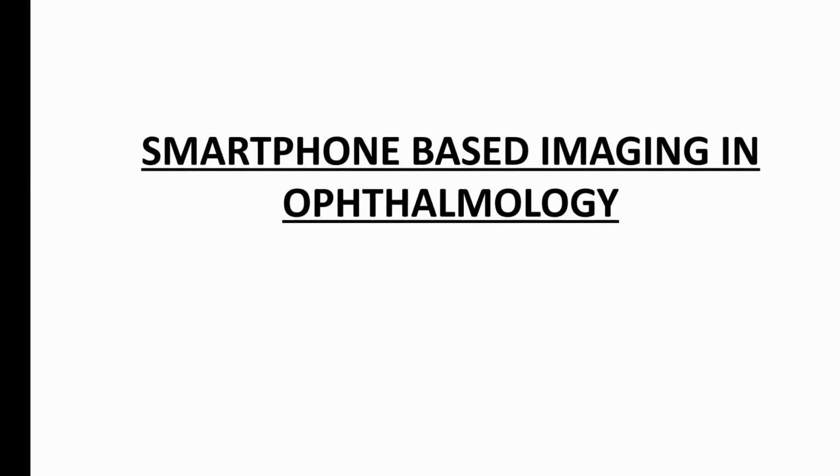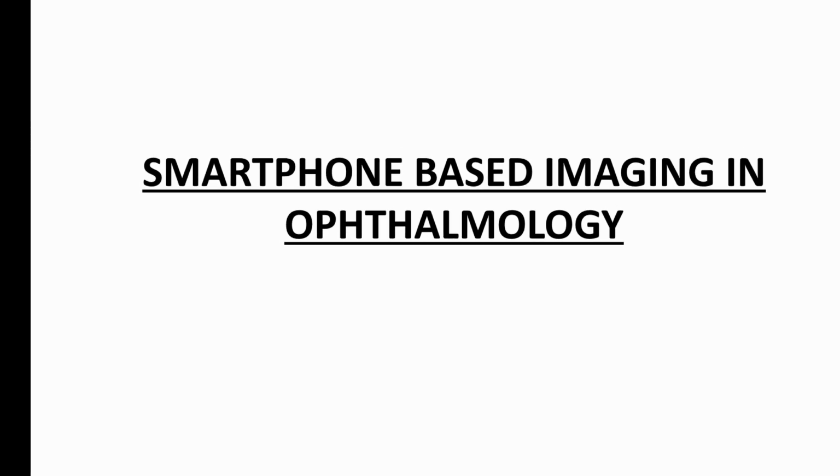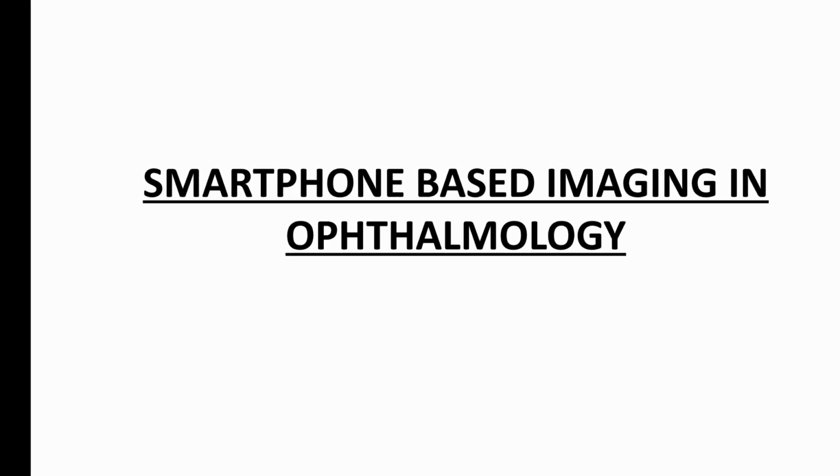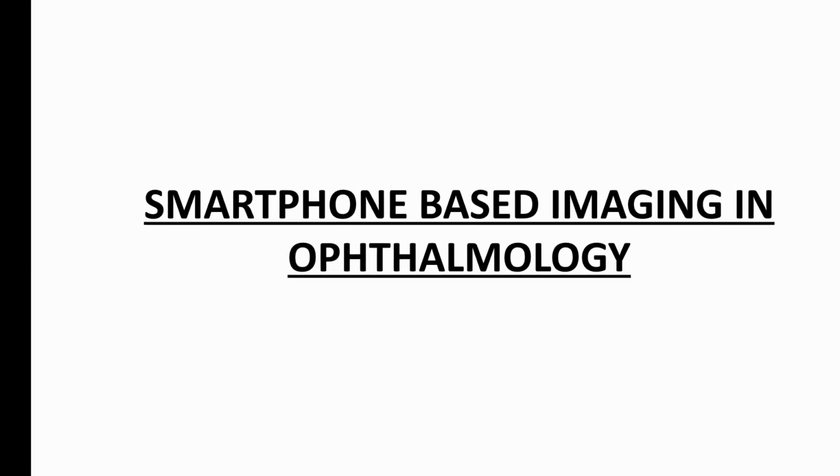Hello everyone. One of the most commonly asked questions from me is, how do you record your videos? Through this video I want to address that question. So I have titled this presentation smartphone based imaging in ophthalmology.